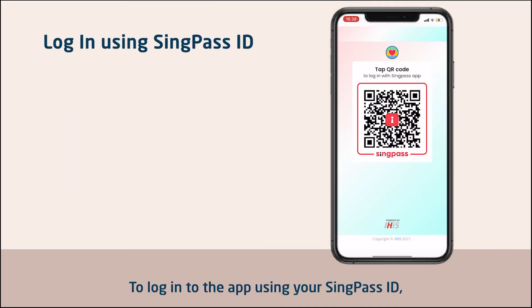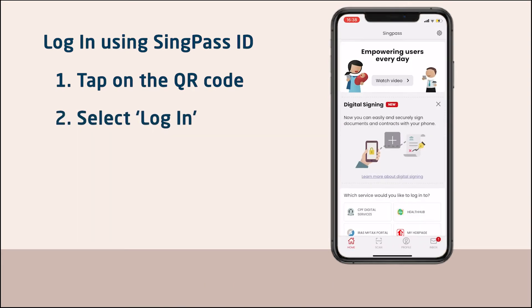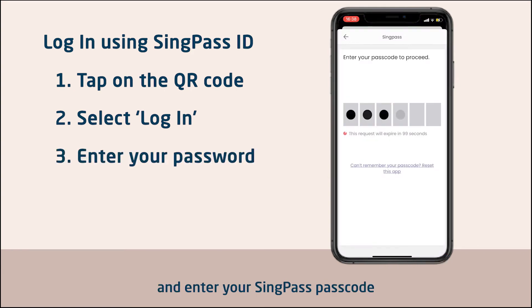To log in to the app using your SingPass ID, tap on the SingPass QR code. Next, select Login and enter your SingPass passcode.